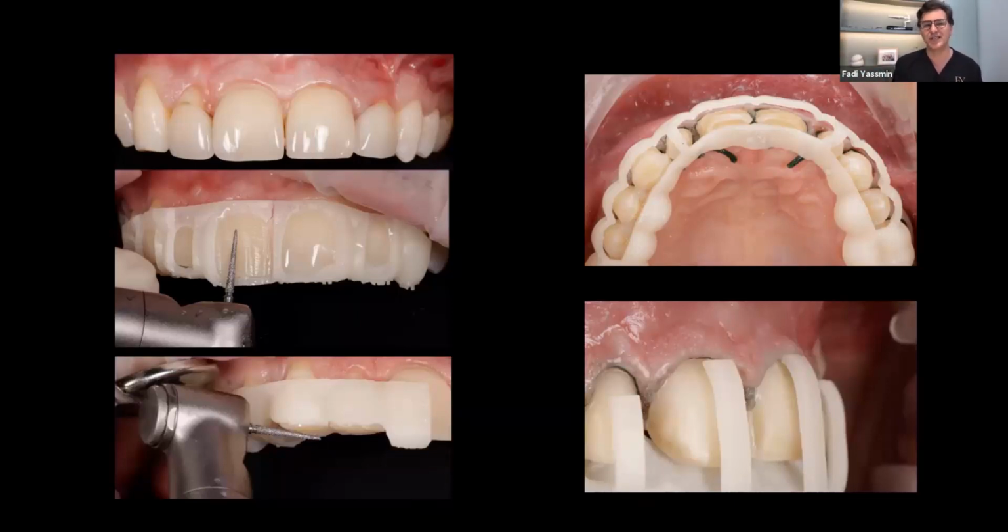And because it's so easy, it's not a big deal. You're better off having more guides than fewer guides. So yeah, and because it's so quick, you don't think twice about it. So we always have a couple of sets ready so that if one breaks, we can replace.